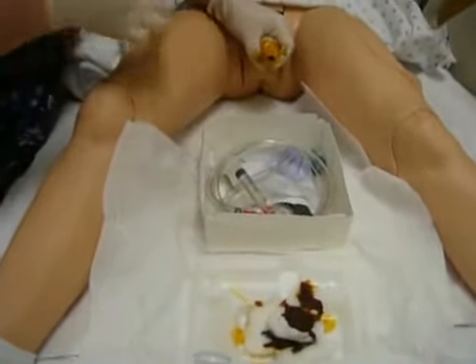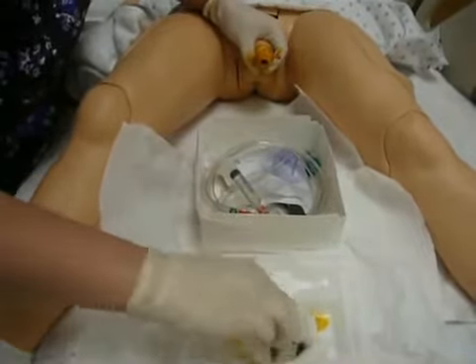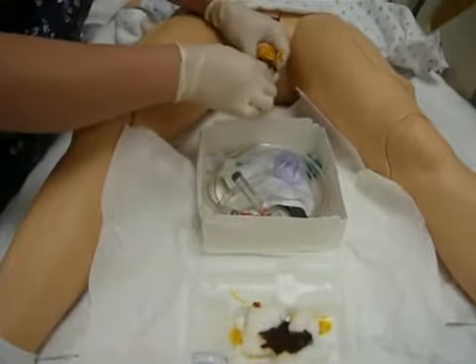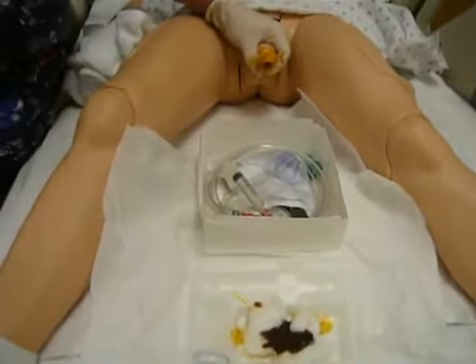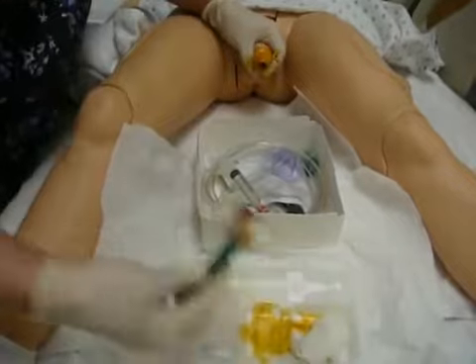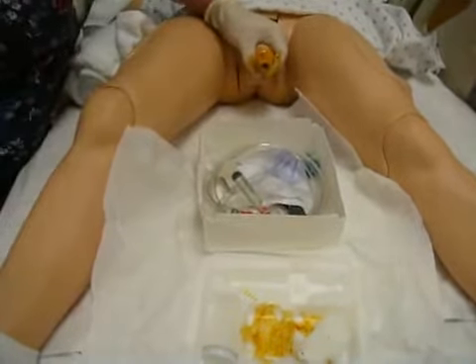Now when I bring the cotton ball around my sterile field so I don't contaminate it, it goes in my garbage pile, which is still on my bedside table, and I grab the next betadine cotton swab, go all the way around, make sure I don't cross over my sterile field, and you do at least 3 cotton balls. And I have my third one, back and forth and around, and there we go.